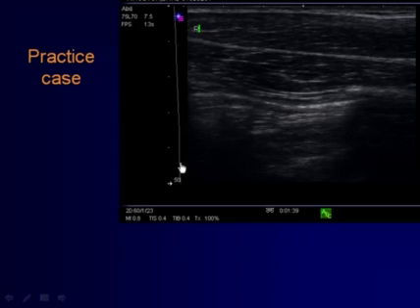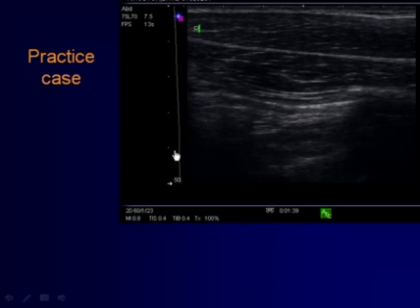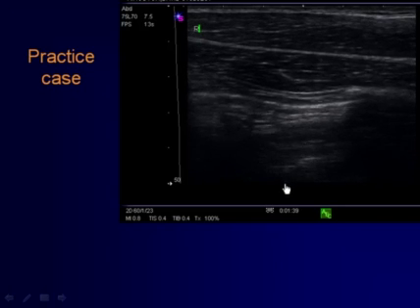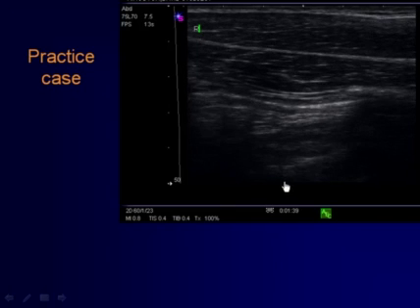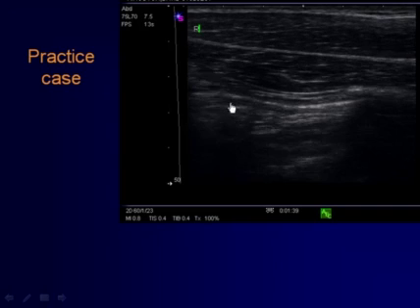In this slide here, we have a rib apparently here without the clear undersurface, but the shadowing is clearly appreciated. We don't have a rib to be seen here, and it's really hard to be sure of what this exam reveals. It's questionable that there might be a flickering here of a lung point.